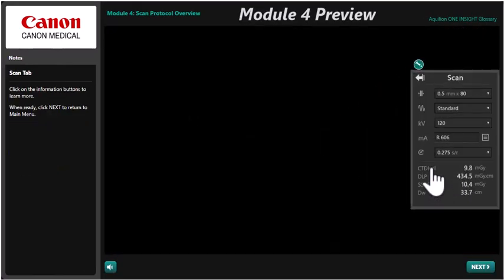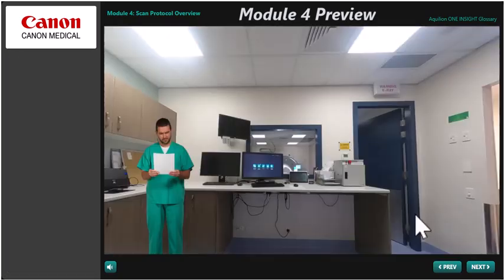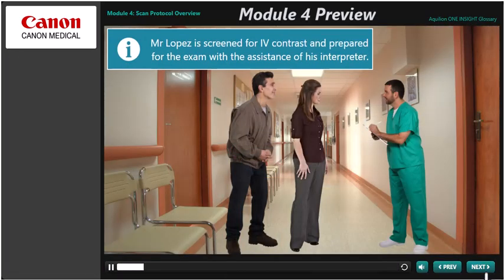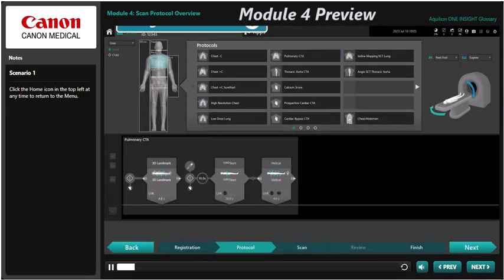Module 4 moves on to take an in-depth look at all the elements that make up a scan protocol. There are also interactive clinical scenarios that take you through how to make protocol modifications during live scanning, such as adding additional reconstructions or adding extra scan elements.